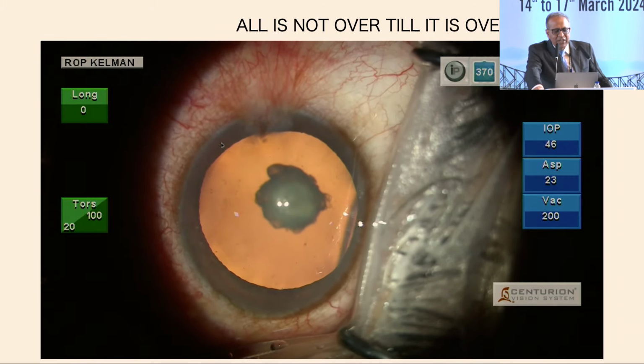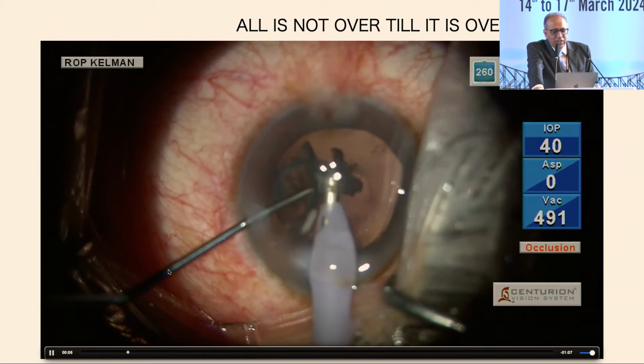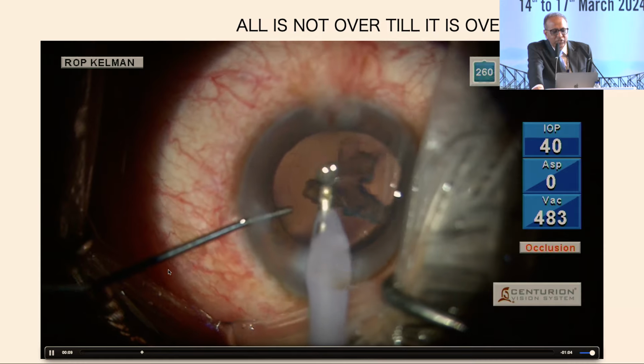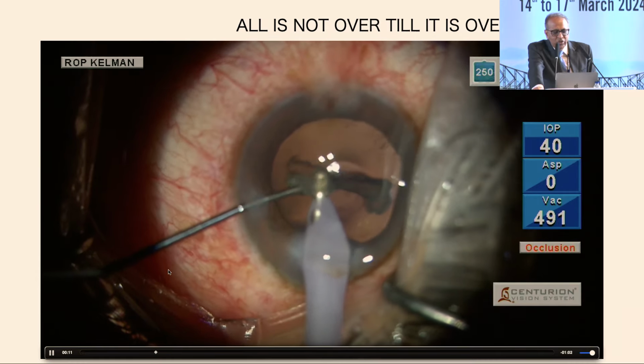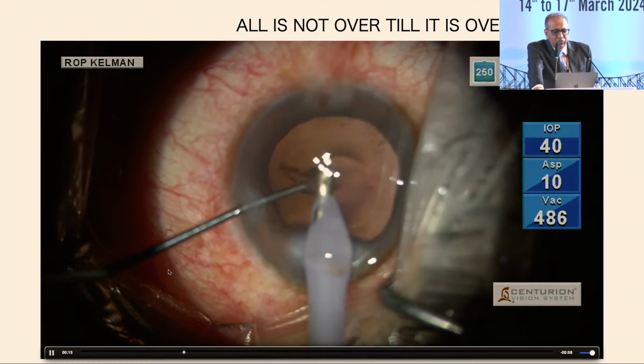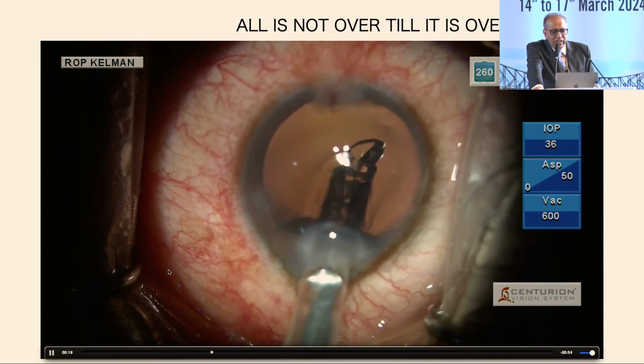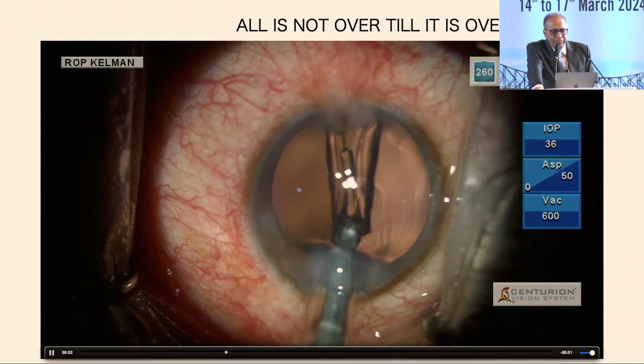This is another patient wherein there was a posterior capsular tear, the posterior polar cataract it was. The surgery continued, and you will find that everything is going on well. So I'm trying to implant the IOL. That is also going on well.